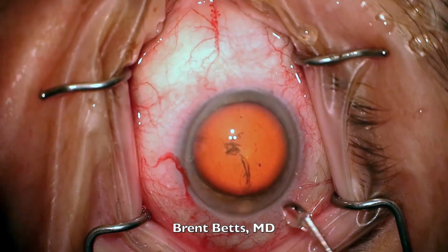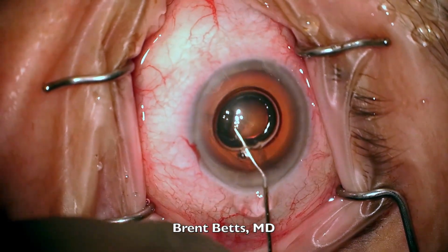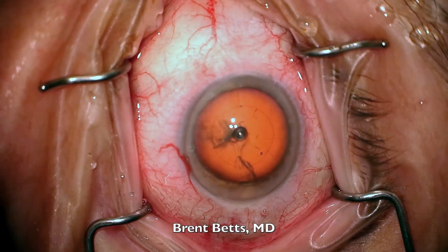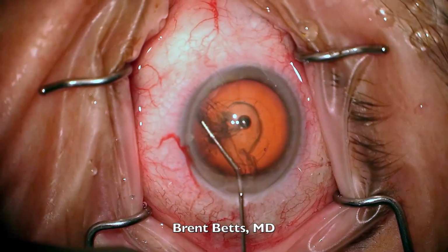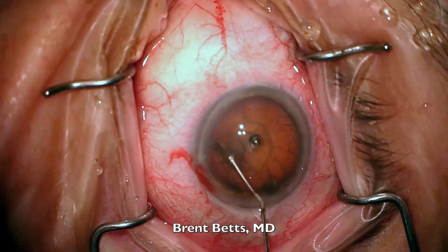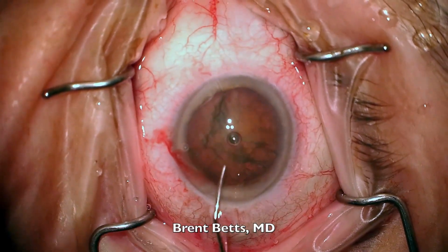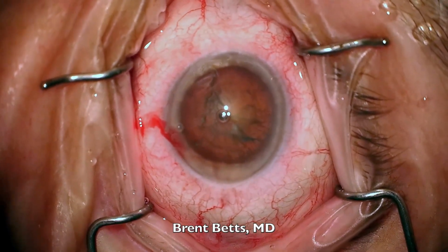The cataract has to be loosened from the capsular bag. This is done using a salt solution on a cannula. Sometimes an air bubble shows up in the cannula; they're easy to remove. The goal is to completely loosen the main cataract from the capsular bag. Your goal is to protect the capsular bag and keep it intact for new lens placement. You can see a fluid wave going behind the lens. I'll rotate the lens just to ensure that it's easily maneuverable, as this makes the surgery much safer and easier.